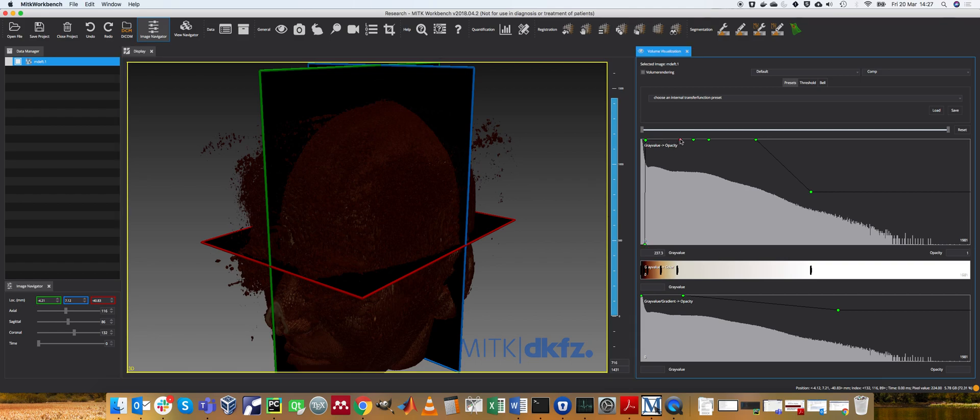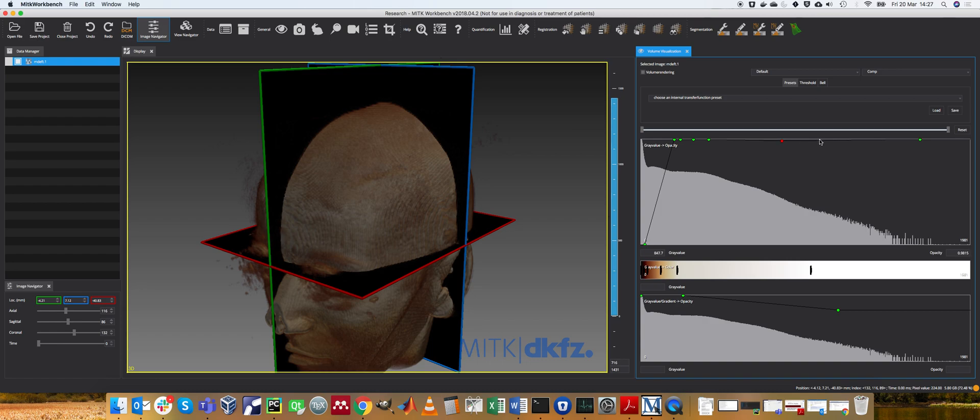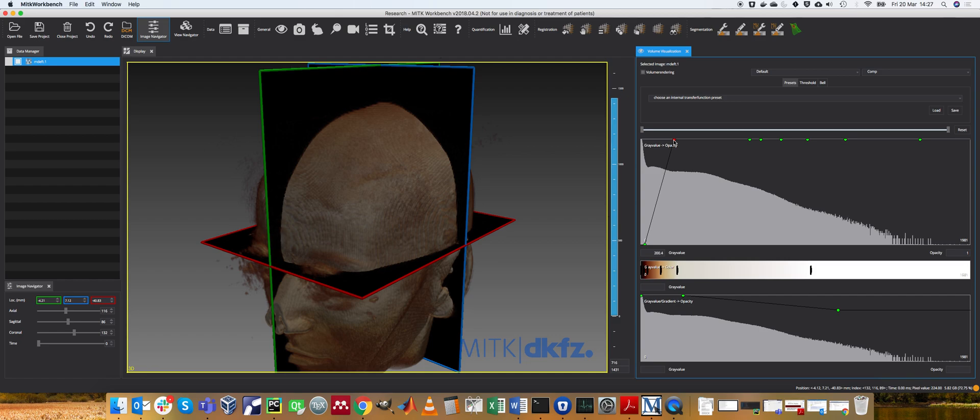As we move these points along, we start to be able to control what can be seen in this image. So let's move all these along.